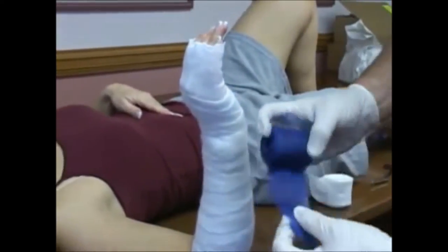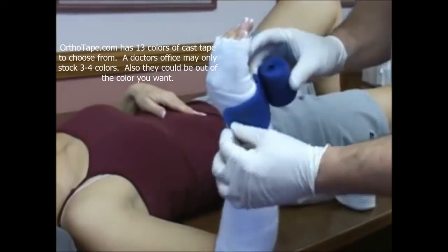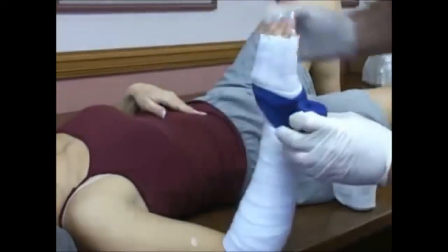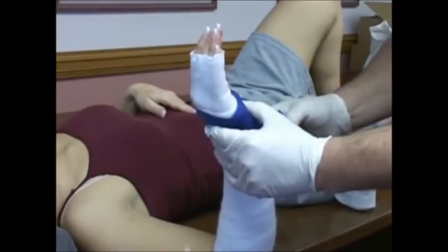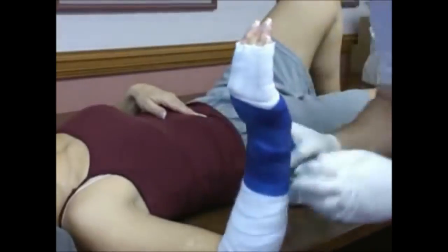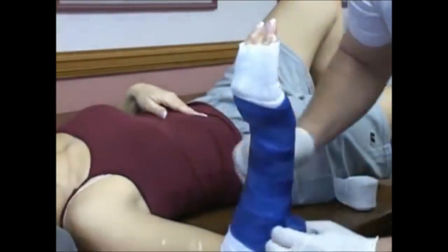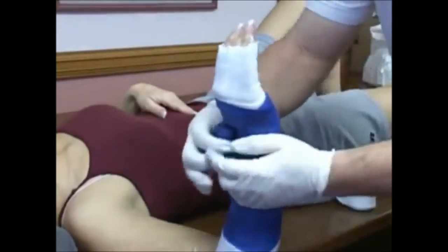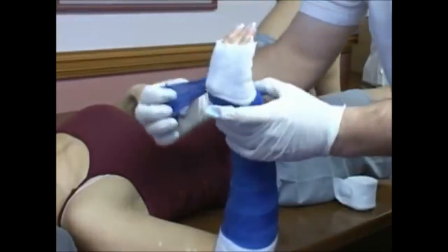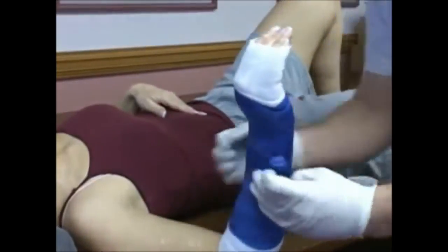I like to start a cast by making a little splint for the palm — this is where most of the wear and tear of the cast is in a short arm. I bring it out to the edge of the palm and pass it through the web space of the hand. I pivot the material and bring it down and around the base of the hand, down the wrist, stopping just short of my padding edge, and bring it back up. Check position, bring it through the web space once more, and bring it down and around carefully — not to get any sharp edge on the skin.